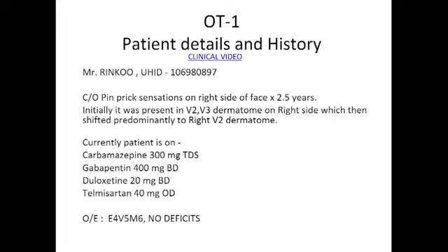Yes, this is all just about. So it gives you a basic idea. Can you focus on the machine, the radio frequency machine? This location to begin with.